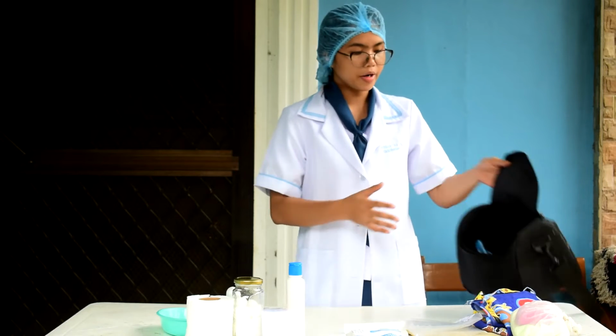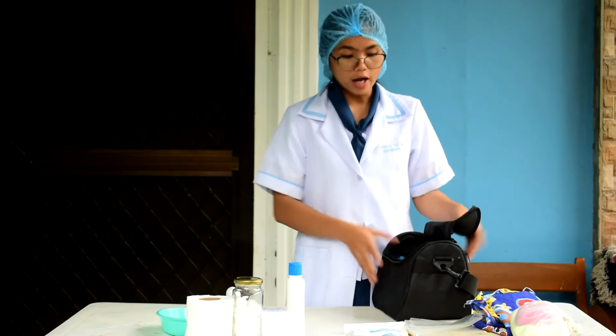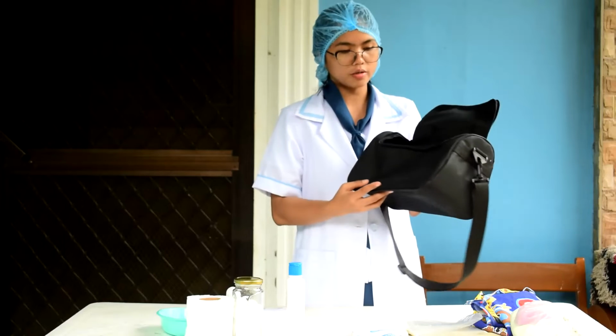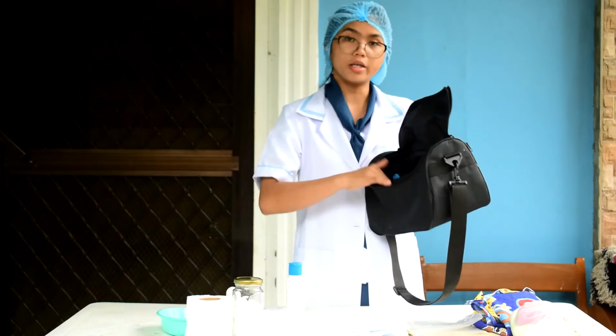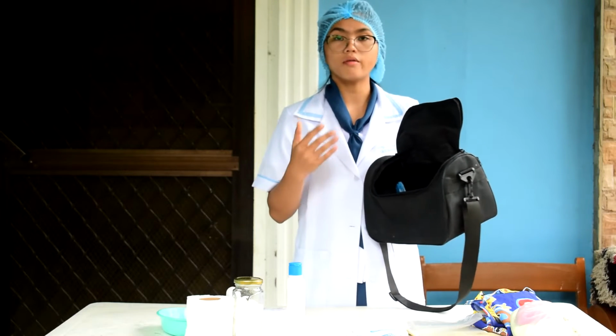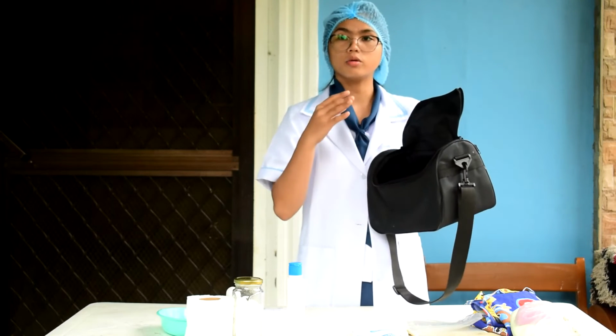So let's go now to the placement of these supplies back together. Let's remember that the bag has different parts. We have here the front part, which contains your thermometer. It can be digital or whatever type of thermometer that you will be bringing. Then you also consider the center of the bag containing all those materials.